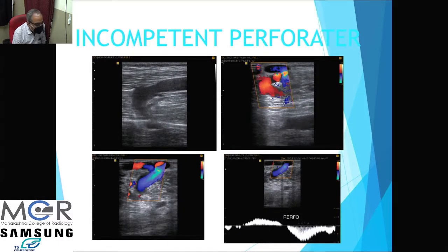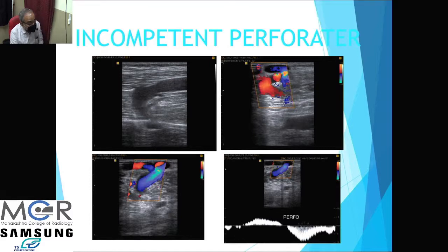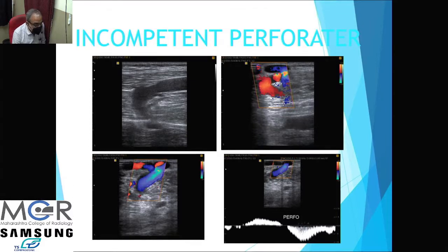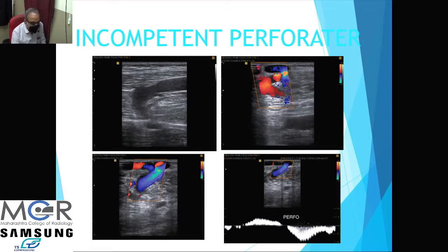A very large and tortuous perforator can be seen in varicose vein cases, with the point of perforation visible. Incompetence must be demonstrated on both color Doppler and spectral Doppler. We will demonstrate this in the case.